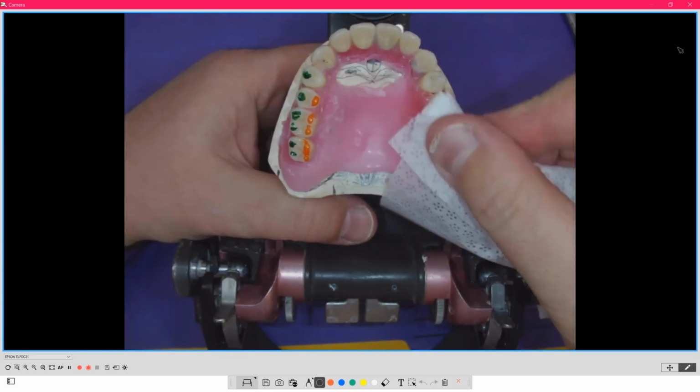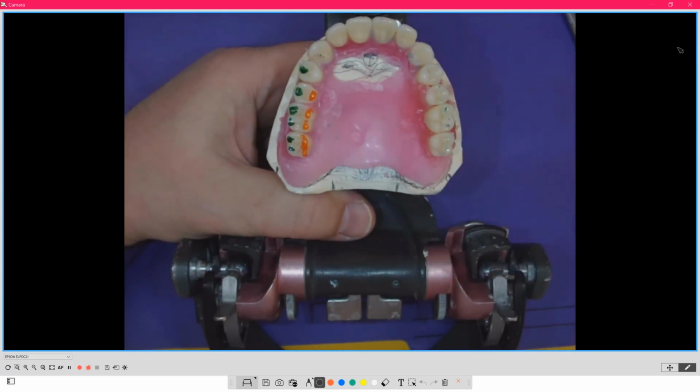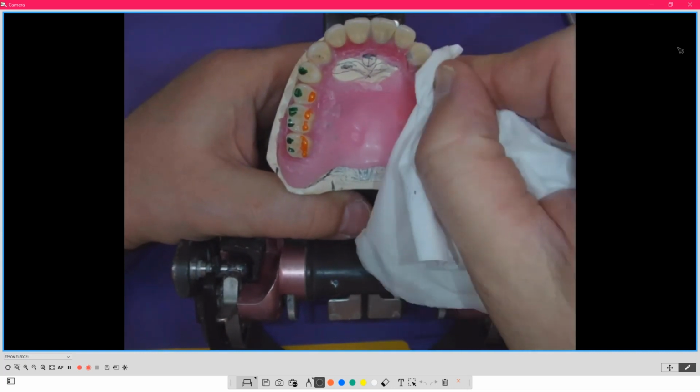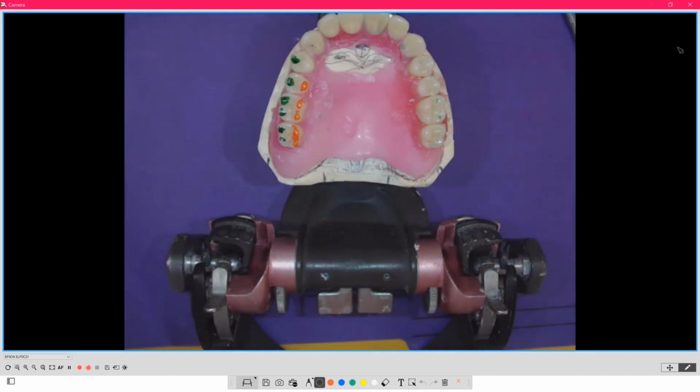And now I'm showing how to check the teeth regarding working and balancing. Now, how do you do that in the mouth? So if the patient comes in on an adjustment and I have an issue now, and say it's even implant based, what do I do? So if you bear with me, I'm going to show you.